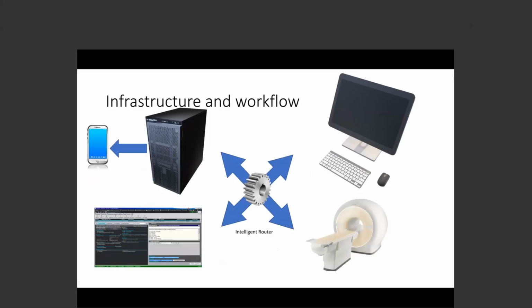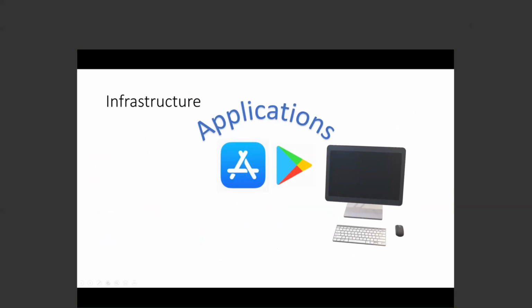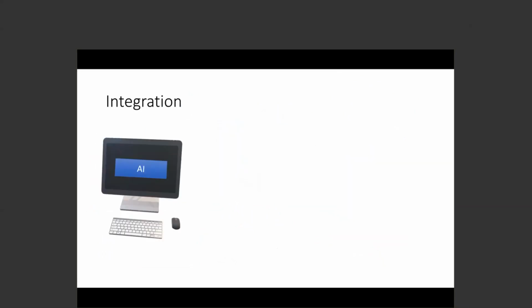One thing that is very difficult when you start implementing these tools in a clinical setting is that each vendor has their own way and infrastructure requirements to put these tools together. What we end up seeing is a number of machines or servers needing to be implemented to address these needs. That's obviously a back-end infrastructure integration need, to decrease the number of servers required. There's a lot of activity going on in making these tools more plug and play, such as we see with big IT vendors, Google and Apple, to make it more streamlined. Certainly an area of interest and need.